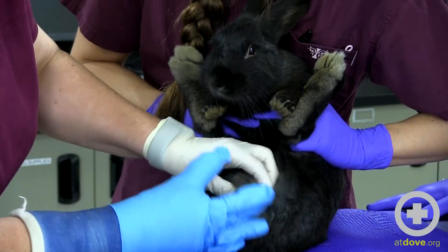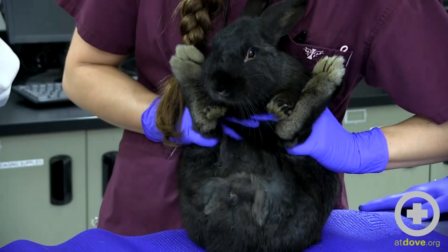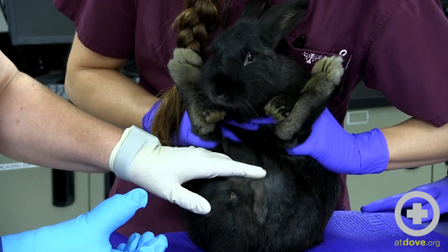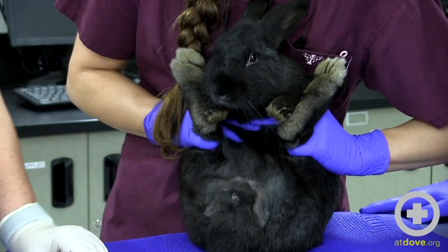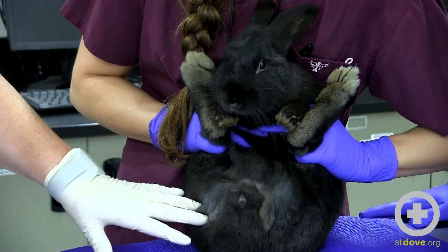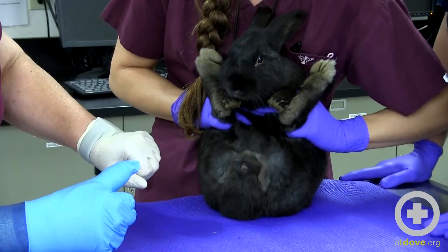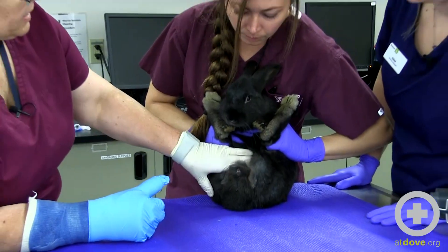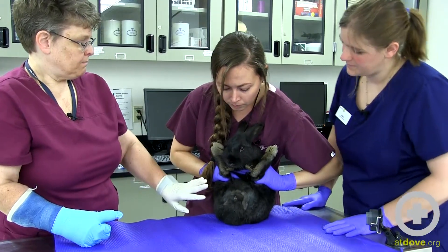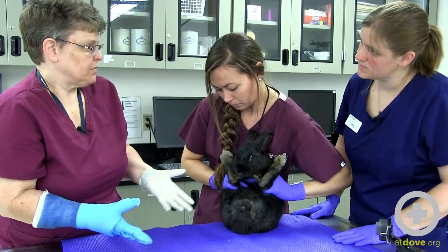We just have to get through the fur but you can see his scrotum there. The older they get, they will get a little larger and can be a little easier to see. They can pull their testicles up into their body cavity, so it can be a little challenging to find sometimes — you have to be a little patient. That's sexing a male rabbit, and this is a very natural restraint hold. It's also good for getting a temperature, palpating the abdomen, or even doing an ocular exam.